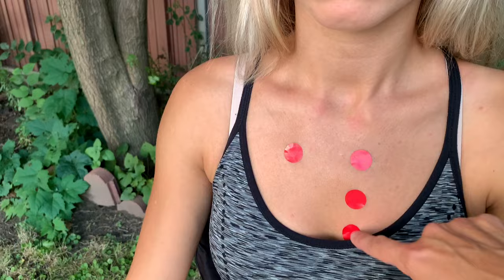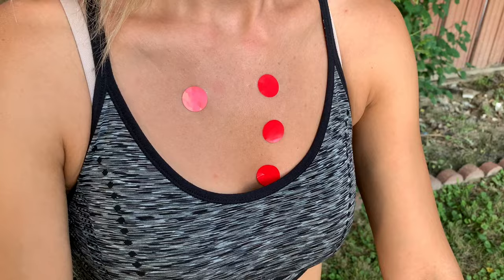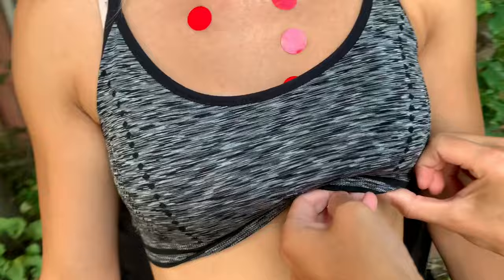Then we're going to go one intercostal space down to the tricuspid valve, which is the fourth intercostal space, left sternal border. The last point is the mitral area, which is the mid-clavicular line — straight down from the clavicle to the fifth intercostal space. On women, there's usually breast tissue in the way, so you listen right underneath. On men, you can go right over that area.